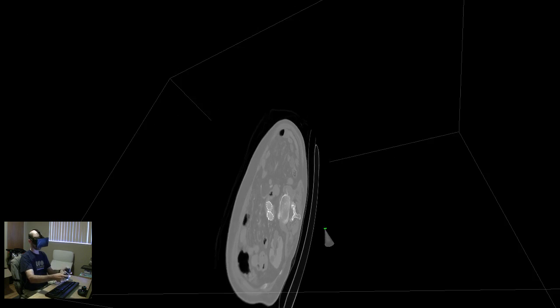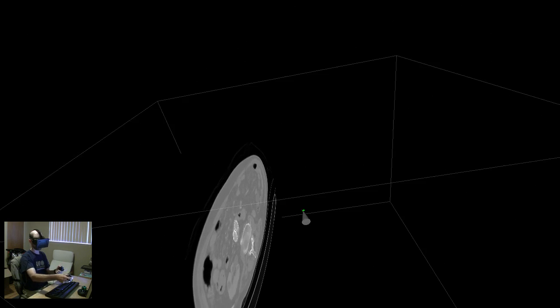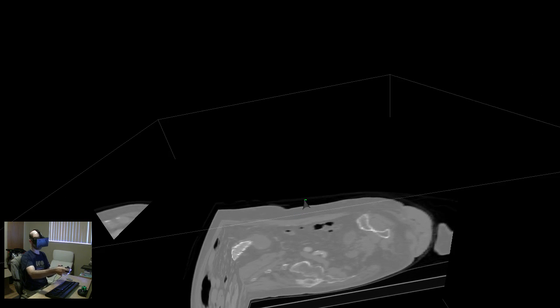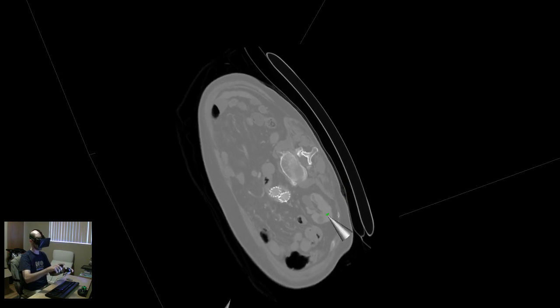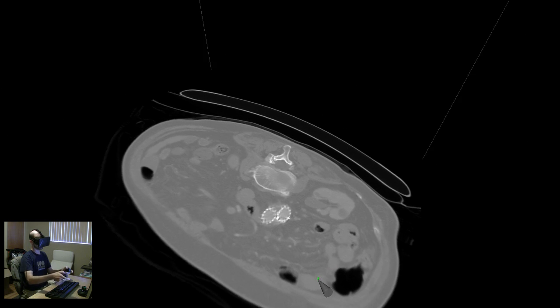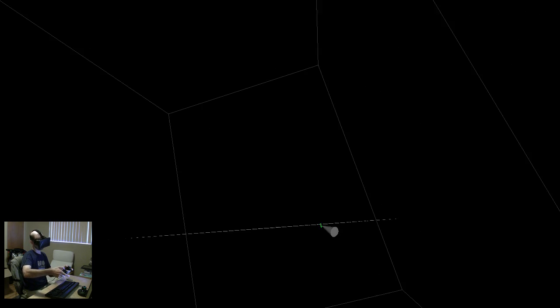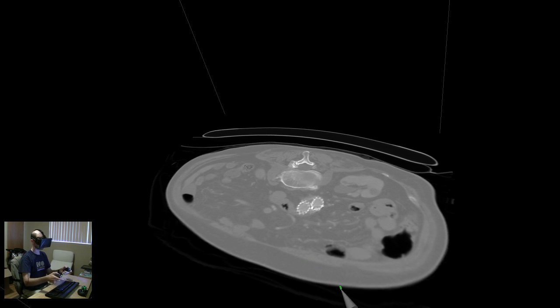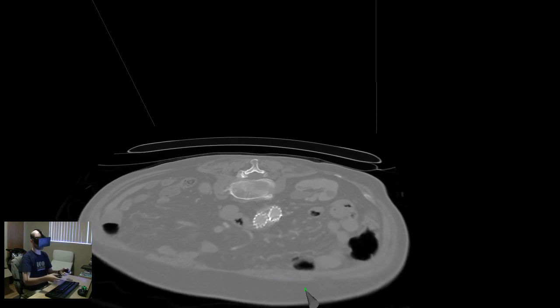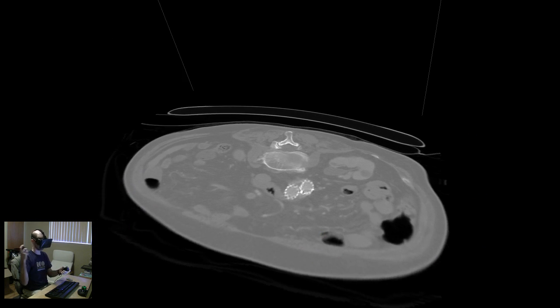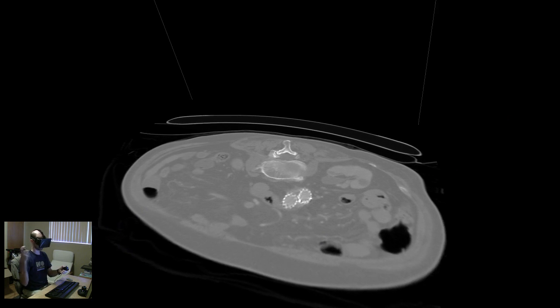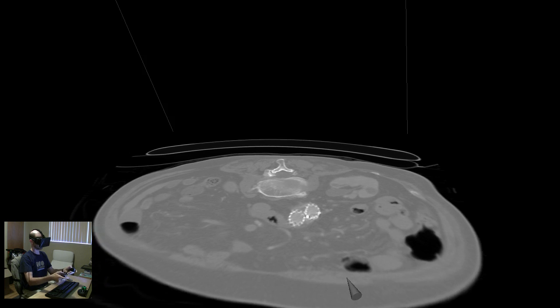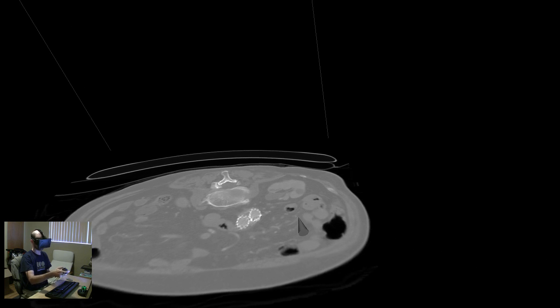Now if I want to, if I let go of the button, the slice stays, and now I can make another slice by pressing the button one more time, but I'm not going to do that. The reason is that slices are fantastic to find very quickly the things you're looking for, but they're really bad at showing you the 3D shape of what those things are.